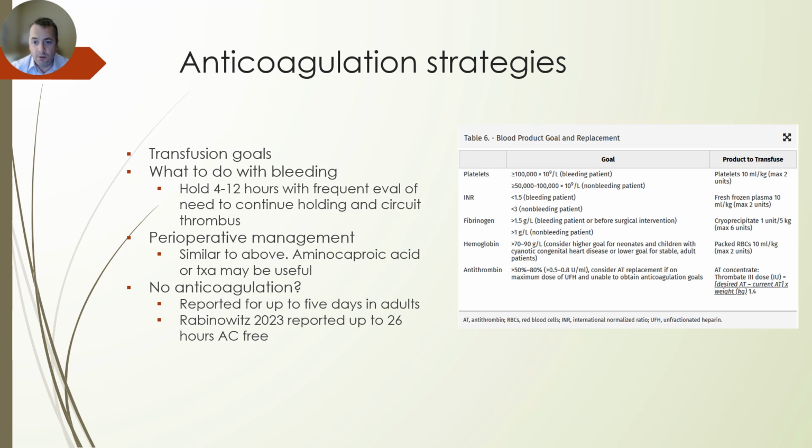You can also both initiate and run VA or VV ECMO with no anticoagulation, at least for a short time. And we talked in ECMO 1 about the pediatric series in 2023, reporting up to 26 hours anticoagulation free with minimal, low rates of thrombosis or bleeding.